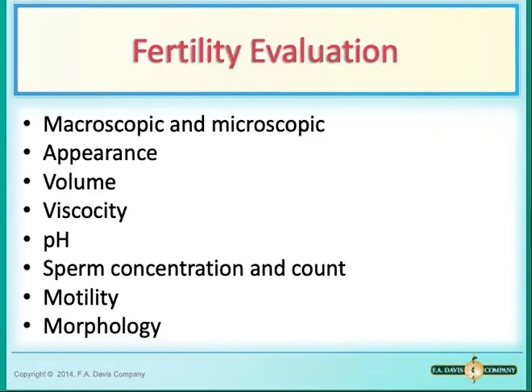Okay, so what do we do when it comes to a semen analysis? Semen analysis for fertility evaluation consists of all of these factors. We look at the semen macroscopically and also microscopically, right?